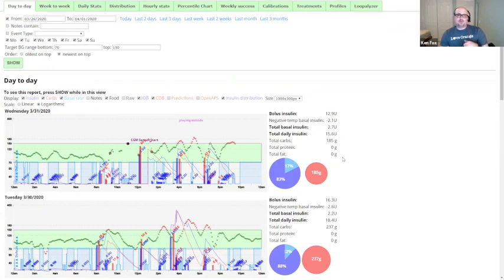It's assumed that when the rate is running, like a certain basal rate is running, that it's evenly distributed across all minutes. So let's say it only ran for 5 minutes, but we know that in some lower situations, it may not have even delivered anything. But it assumes that all that insulin, that rate, was given every single minute, even though maybe a delivery didn't even happen, no click of insulin was delivered. So it's going to overestimate how much insulin is being delivered through basal.